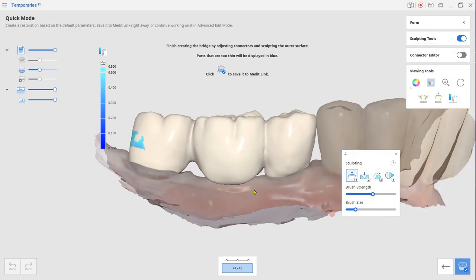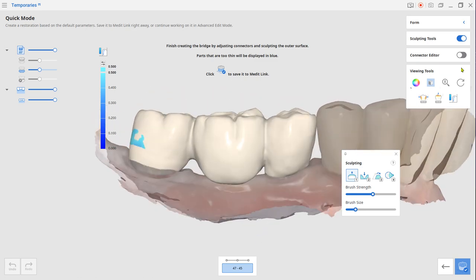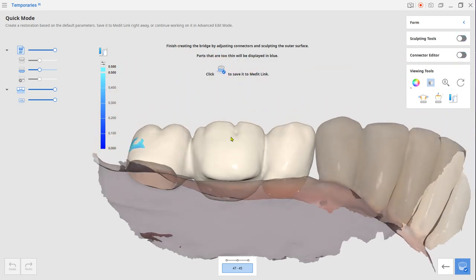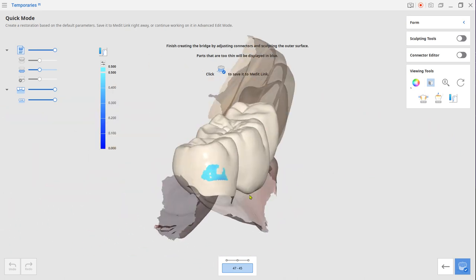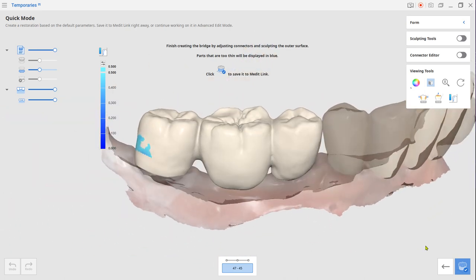Next, use the connector editor if needed. Review the temporary design and click Complete to save it.